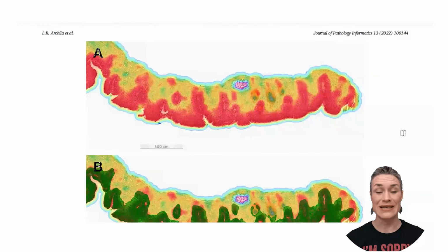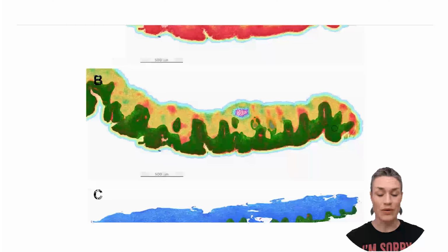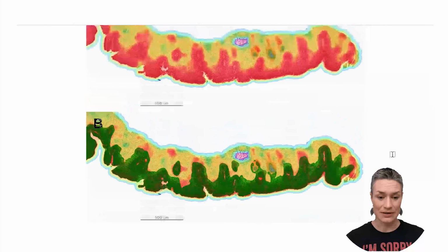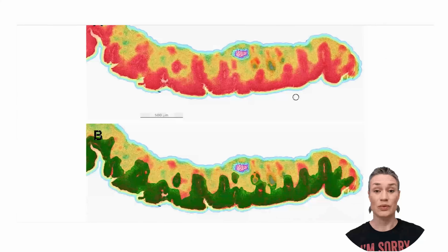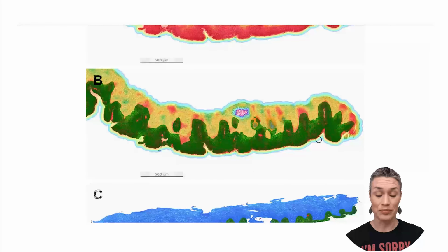These are images of biopsies with image analysis markups. And the first one is a density heat map of epithelial nuclei. And you can see that here in red is the highest density of nuclei, which corresponds to our basal layer. Makes total sense because in the basal layer, like you saw on the native image here, there are more of those nuclei, so the density is going to be higher. So we see it here in the heat map, and it corresponds to the appropriate class.